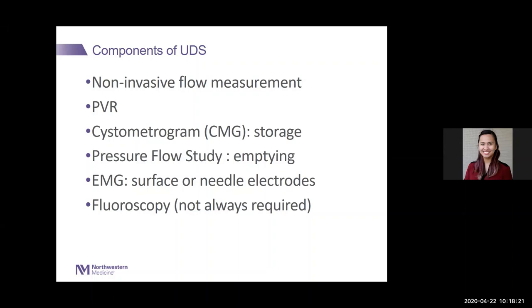Needle electrodes are, as you can imagine, a needle in your perineum, or multiple needles in your perineum, trying to evaluate your pelvic floor and the external sphincter. They are not comfortable, and are often used for research purposes or in patients that are not sensate. Particularly, we don't use these. And fluoroscopy may or may not be required depending on the patient.